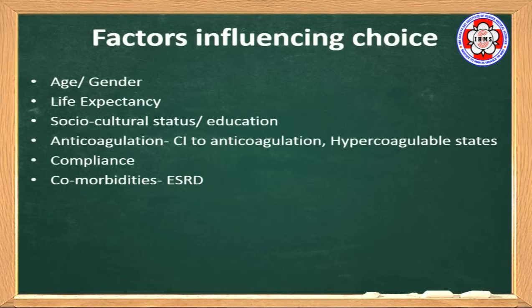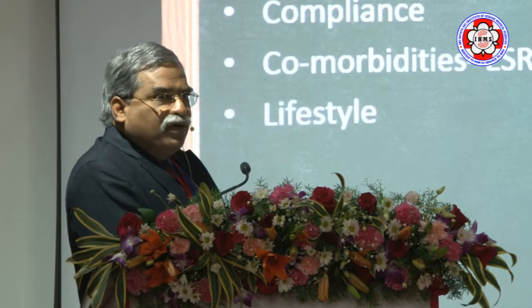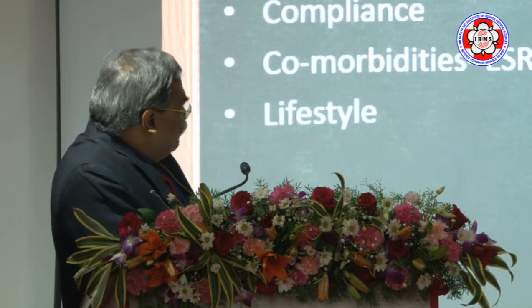And one of the comorbid factors: now we see more and more end-stage renal patients, either on dialysis or who have had a renal transplant, coming up for valve surgeries. Then we need to decide what valve to use in those situations. And the lifestyle. Even some of the very young ones, executives, travel worldwide and want a simple lifestyle. They don't want to take anticoagulation, or somebody interested in some sports activities prefers a tissue valve. Even with a class 1 indication, you should discuss with the patient and find out their lifestyle, what they want, what the need is, then you should select the valve.